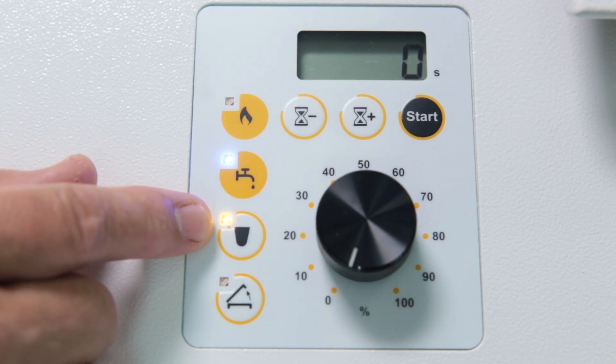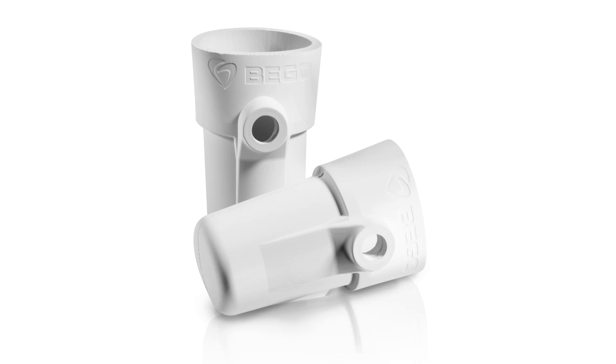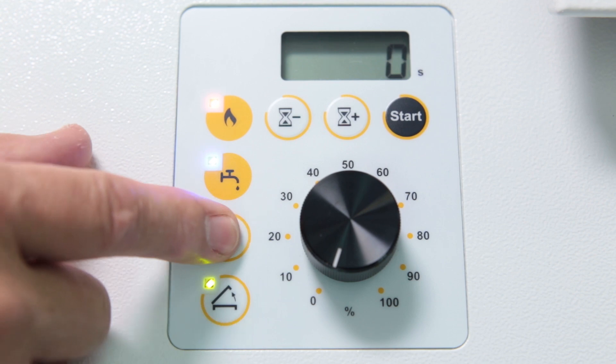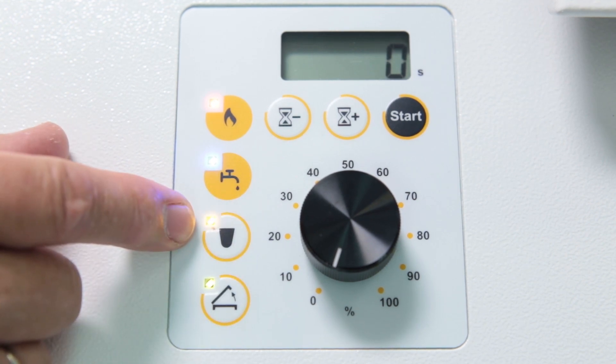This button indicates which crucible or insert is being used. In this case, it is a graphite insert. Ceramic or glass carbon inserts are also possible. It is recommended to use original Fornax Ceramic Crucible FC and matching inserts. Pressing the button selects the insert and the associated speed.